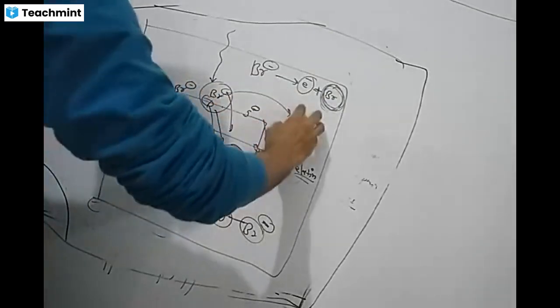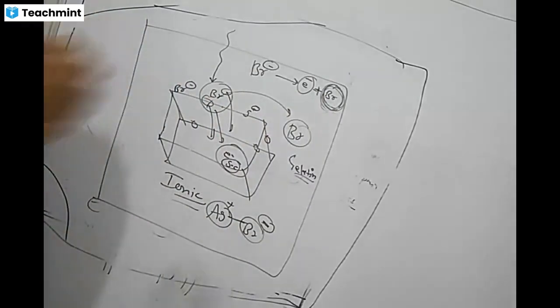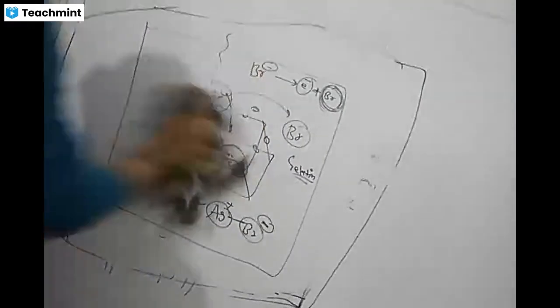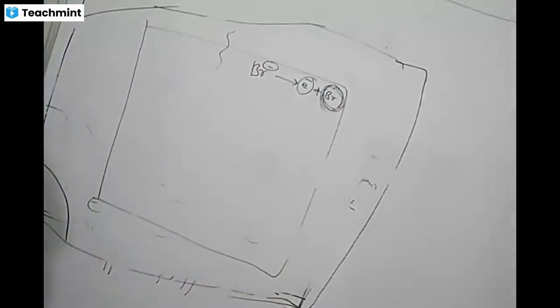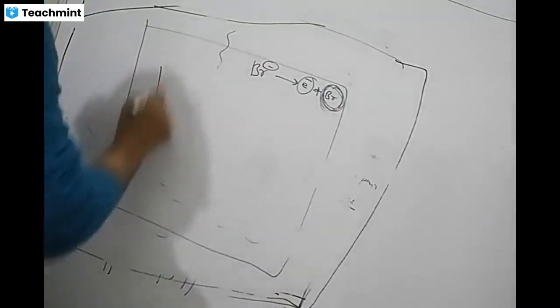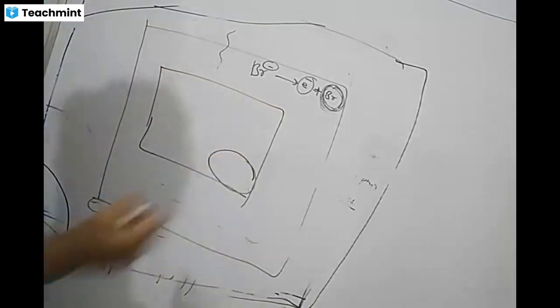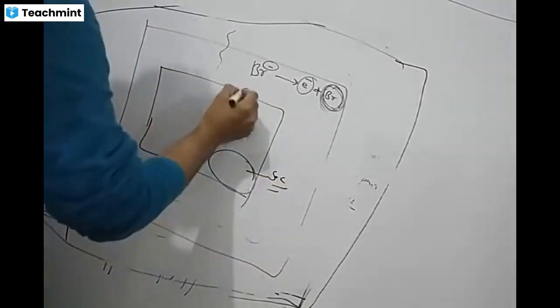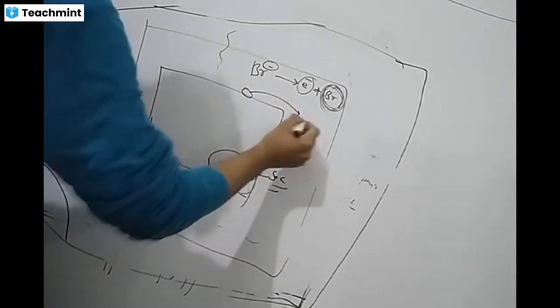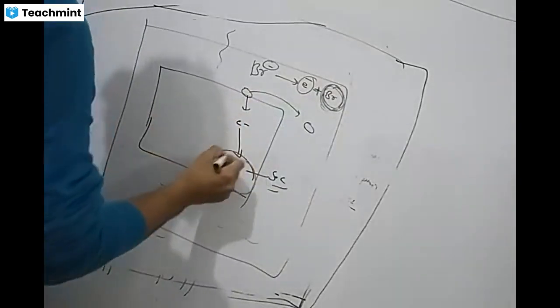It will come out into the gelatin. Similarly, this is the sensitivity center. From the surface, the atom will go into the gelatin and the electron will come here.